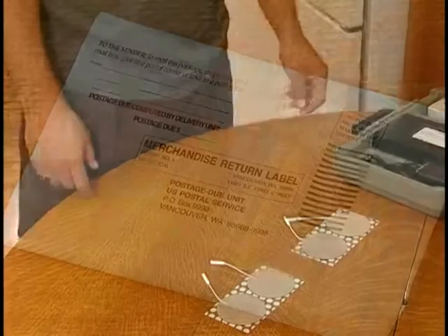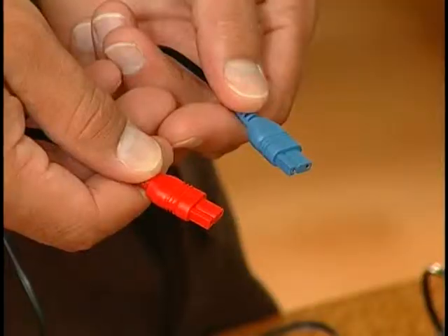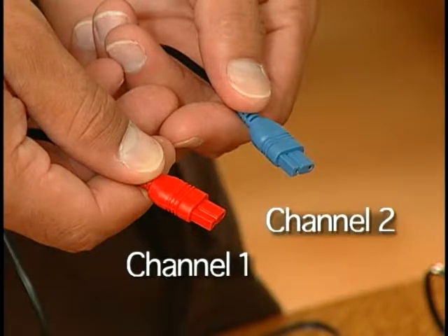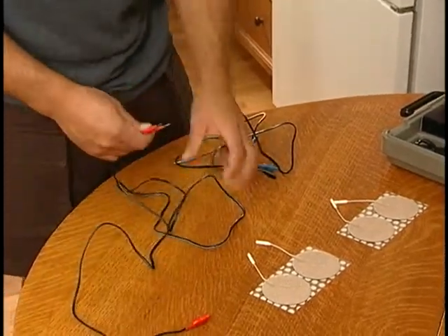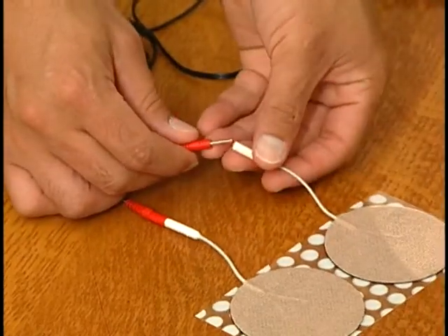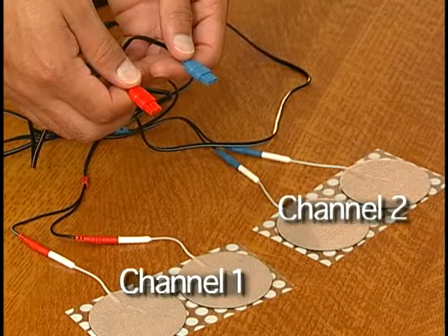The stimulator is easy to set up and use. First, remove the cables and the pads from the case. You will notice that the cables are colored at each end. The colors are designed to help you set up the stimulator. Choose one color to represent channel 1 and the other to represent channel 2. It doesn't matter which color goes with which channel. While keeping the pads on their plastic sheets, slide the tails of each pad over the metal ends of the cables. Each cable holds two pads. The pads attached to the channel 1 cable will be the channel 1 pads, and the pads attached to the channel 2 cable will be the channel 2 pads.